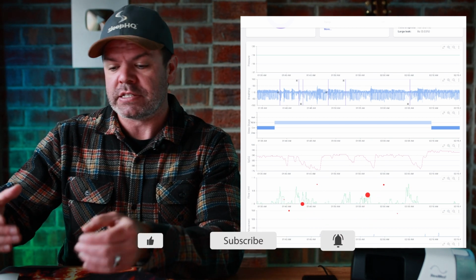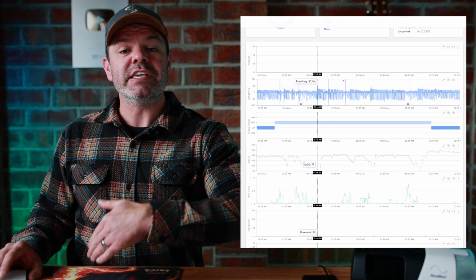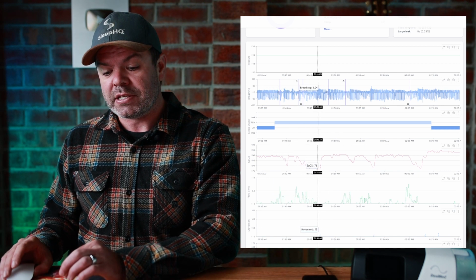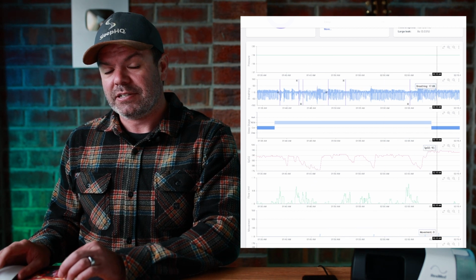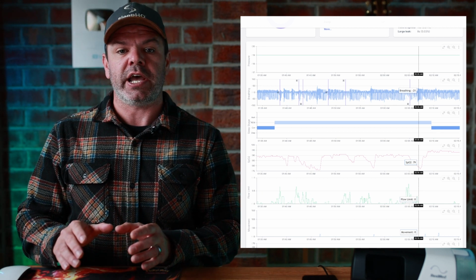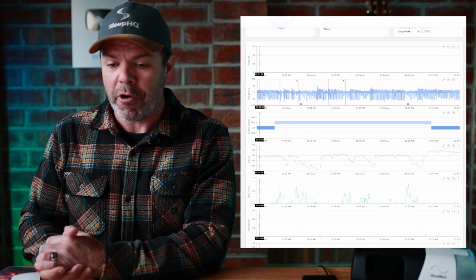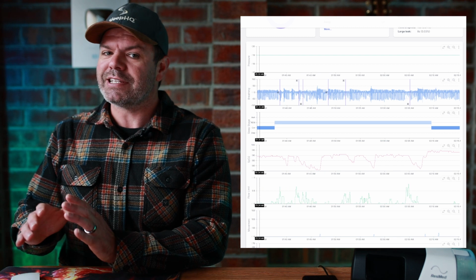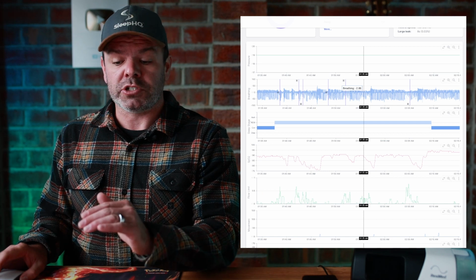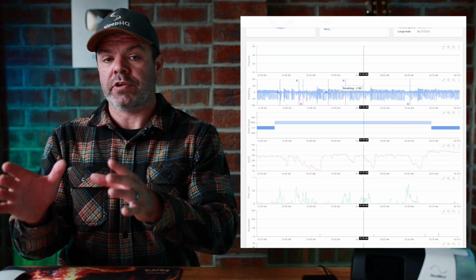And we can get some great insights into his therapy. We can see that during REM, his blood oxygen levels are dropping, his breathing is irregular, there's a lot of airflow resistance, the green chart here, and it's disturbing his sleep. We can see it with the movement spikes. So pressure isn't adequate during REM, or perhaps it is, but he just needs to change his sleeping position. Because I can see right here, he's already on 19 centimeters of pressure, hurricane force. So perhaps he just needs to stay off his back. And this would improve the breathing trace, no oxygen drops, no disturbed sleep. Great. That's why it's fantastic to have accurate time.